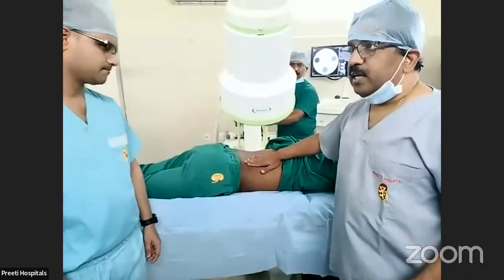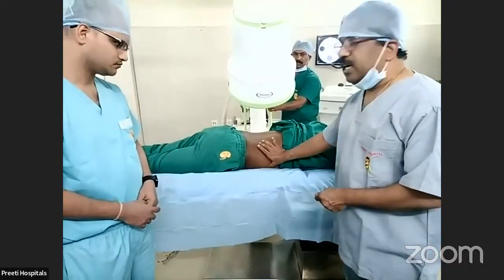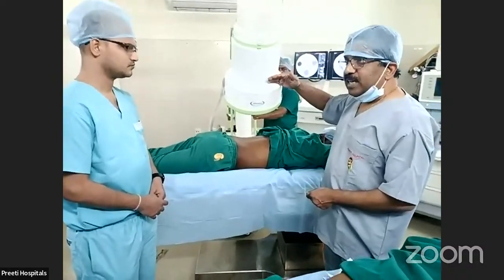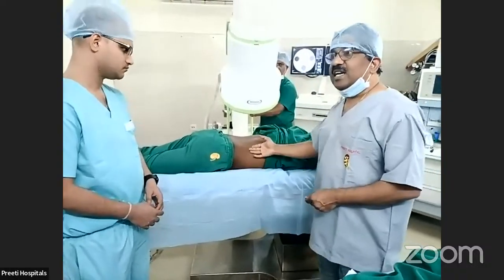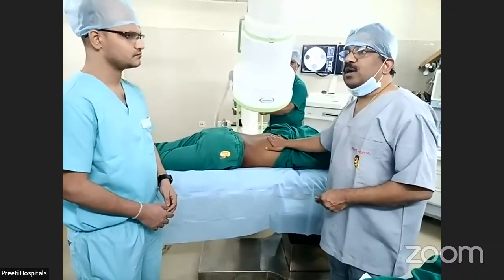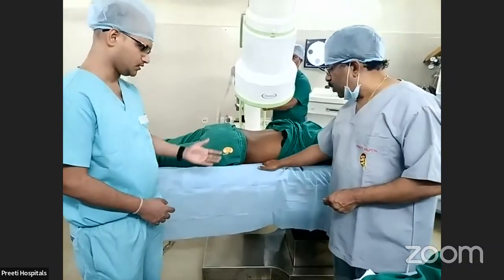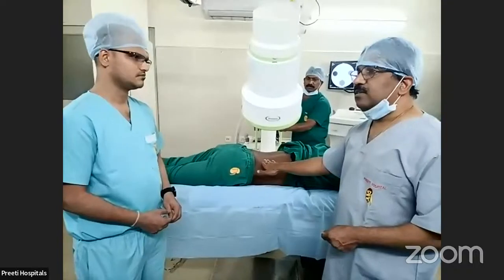At 0 degree, you have punctured and you want to see the depth, so you turn the C-arm 30 degrees towards your side, upper end as the receiver, then see the needle. If the needle goes towards the spine, you are posterior to the stone. If the needle is away from the spine, your needle is anterior to the stone. Withdraw and go more posterior.